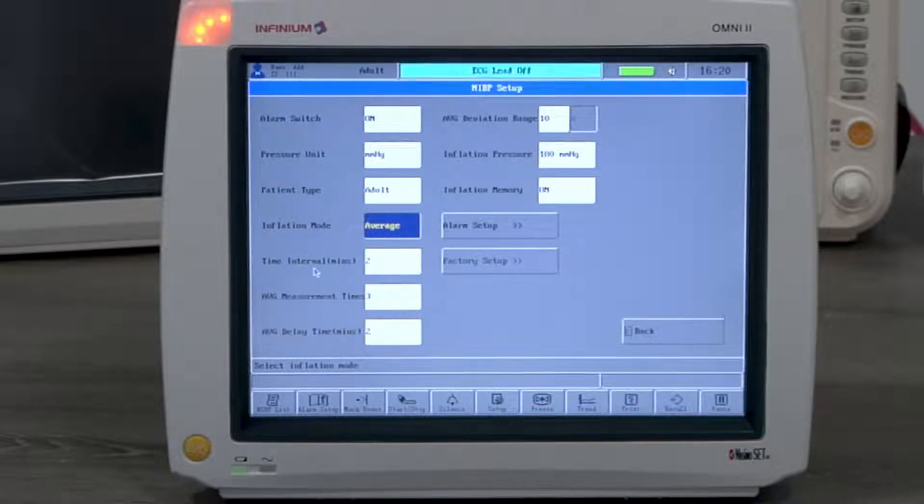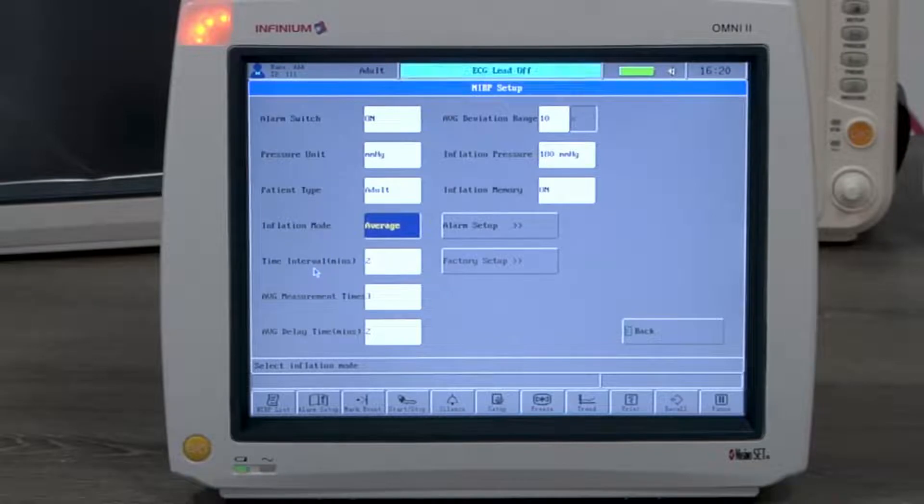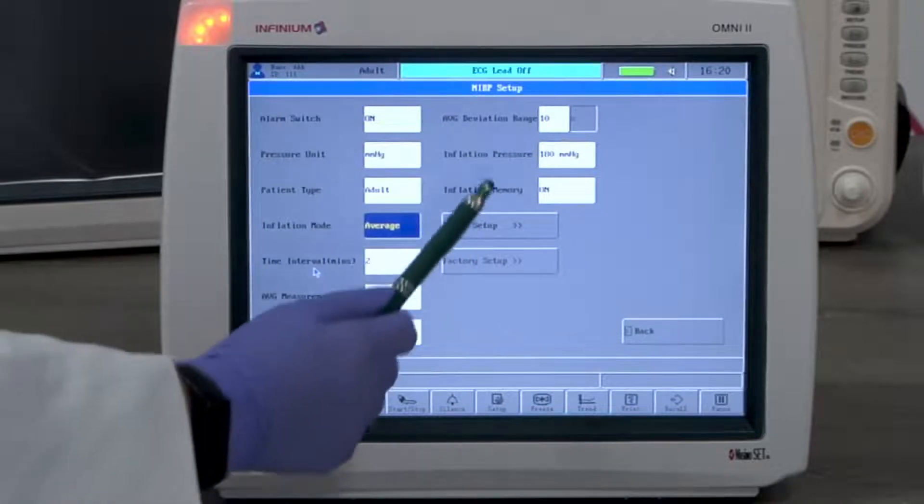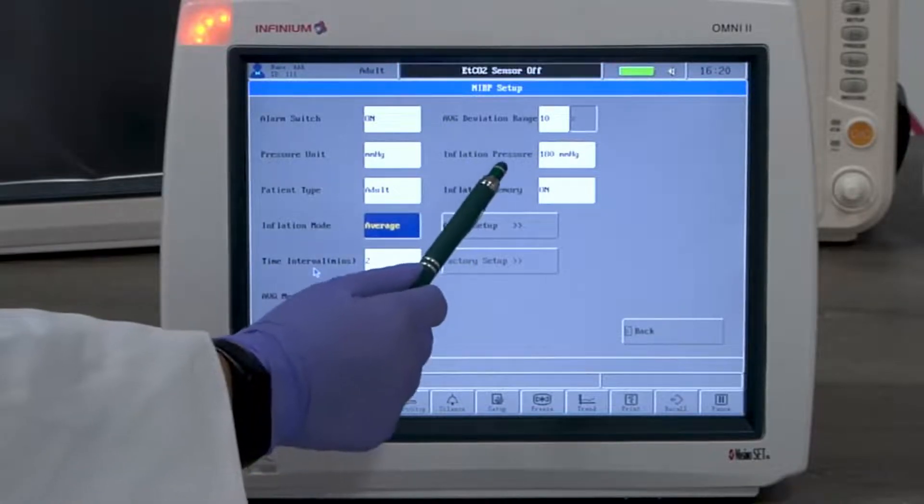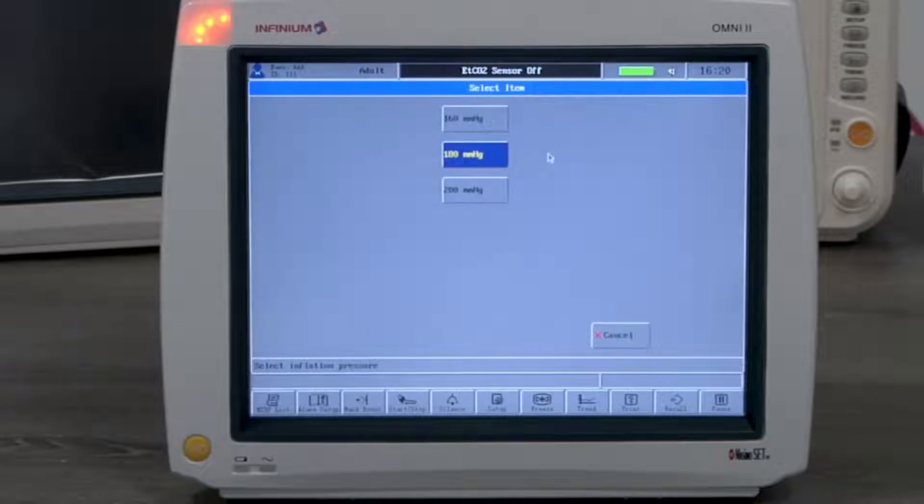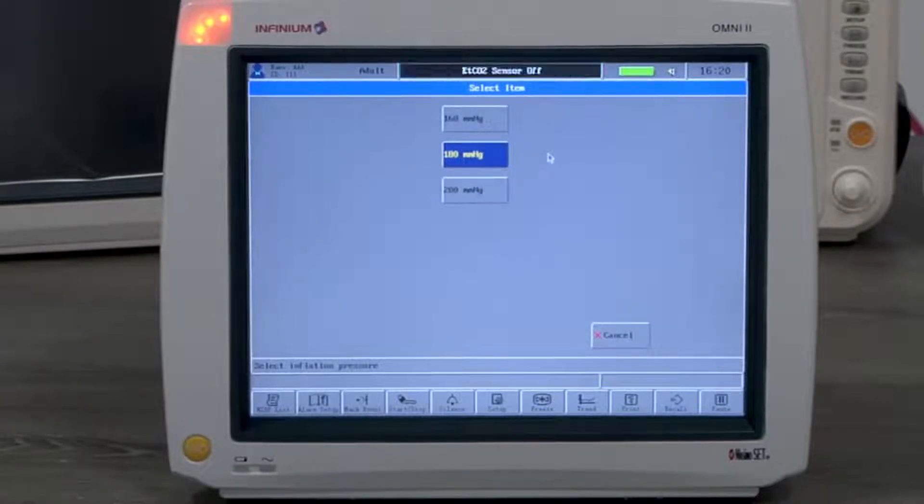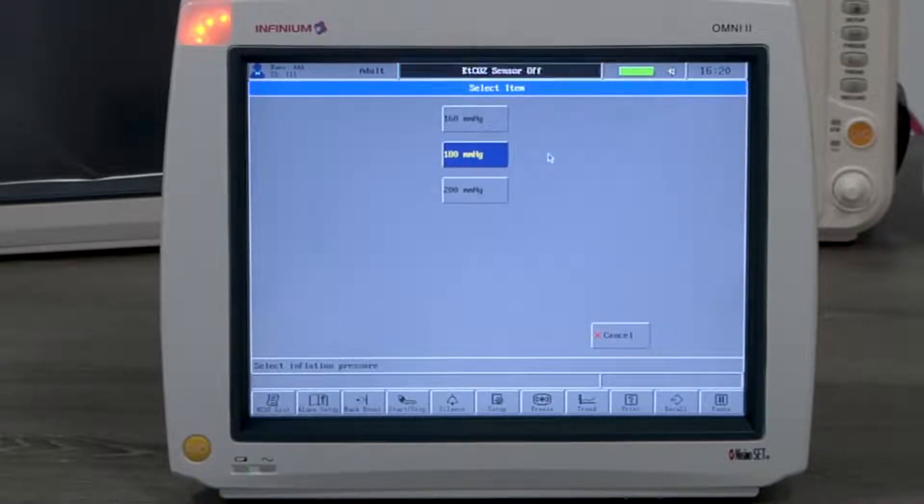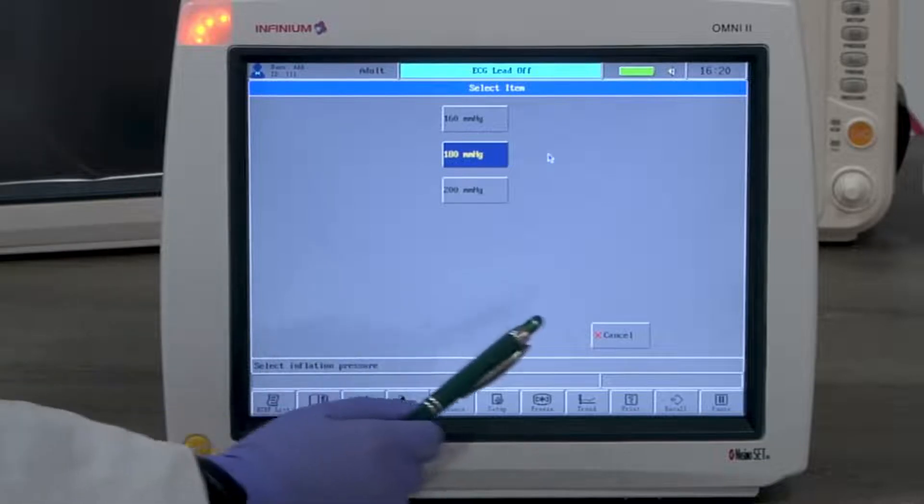The inflation pressure is the initial inflation pressure. The default is 180, and it can be set to a lower or a higher value depending on which one fits better in the clinical use.